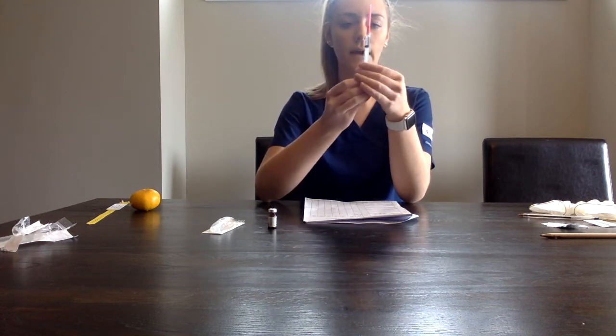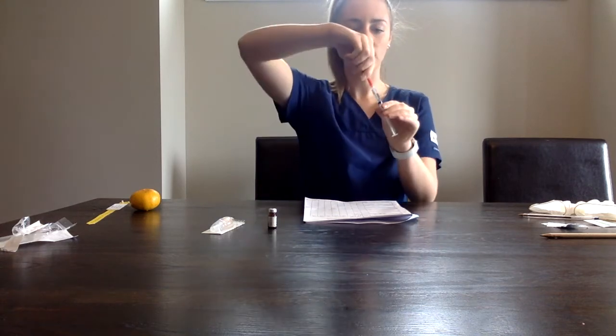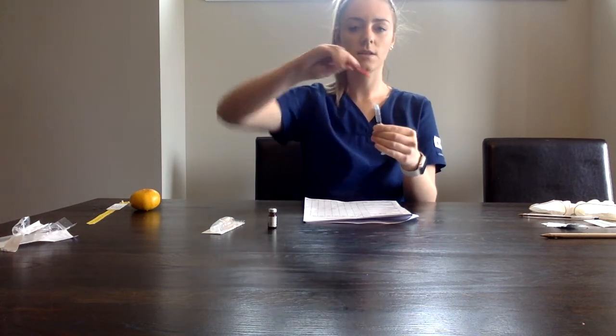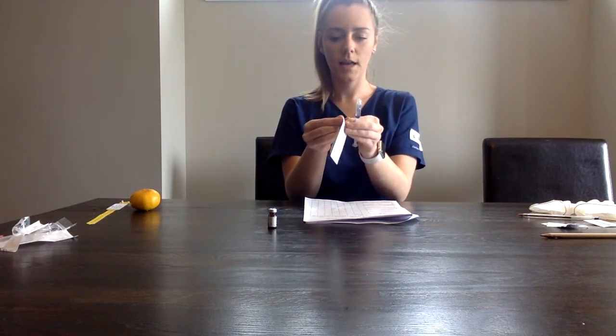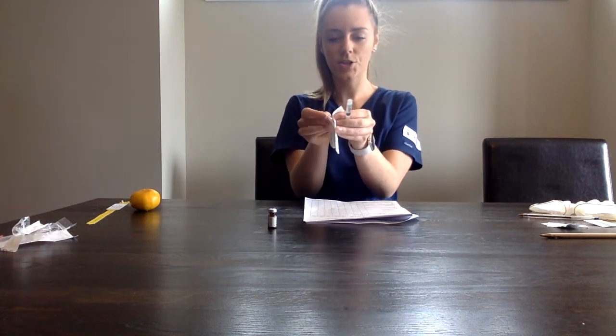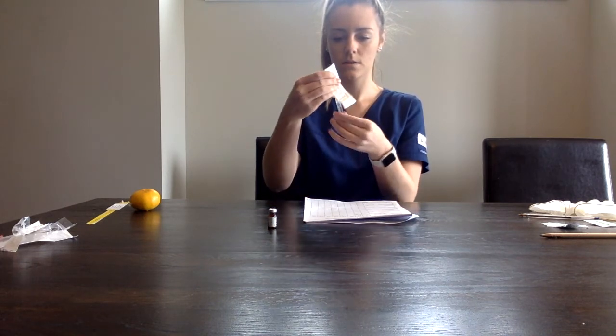Okay, so I want to verify the volume. Before we change to our injection needle, we'll want to pull back completely on the plunger to make sure all the med is in the barrel. We can take off the blunt-filled needle. This will go into the sharps container. And then again, we'll peel back on our injection needle and attach it. And then we want to recalibrate it to the correct volume back at the 1 ml mark.